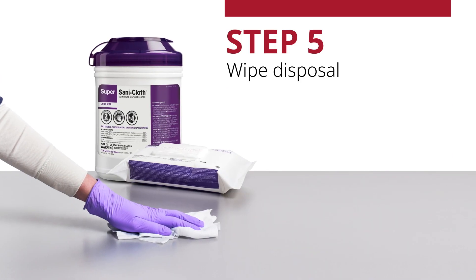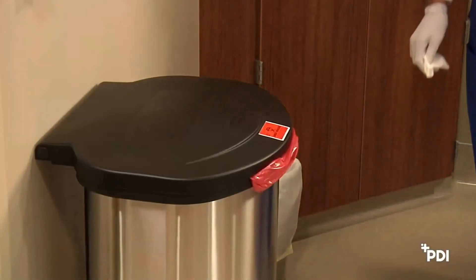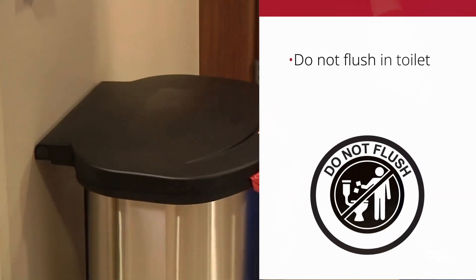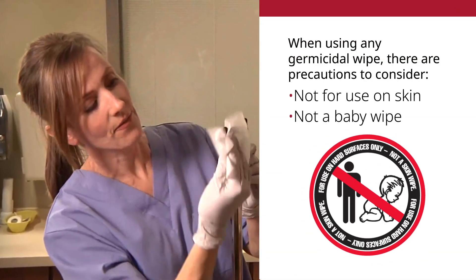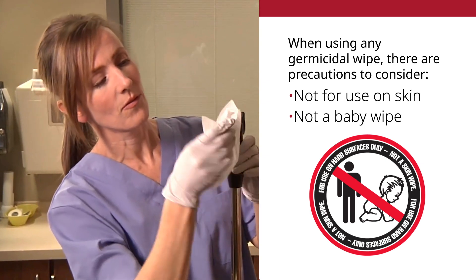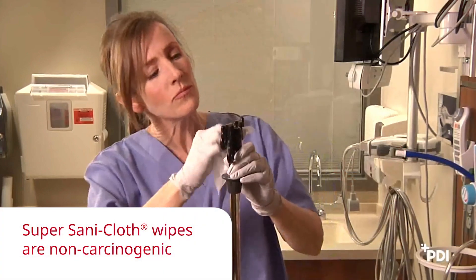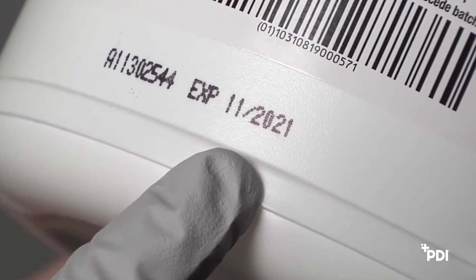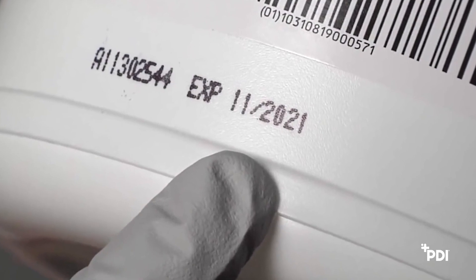Step 5: Wipe disposal. Dispose of used wipe in trash or in accordance with your facility's regulations for infectious waste disposal. Do not flush in toilet. Do not reuse the wipe. When using any germicidal wipe, there are precautions to consider: these wipes are not for use on skin — this is not a baby wipe. SuperSaniCloth wipes are non-carcinogenic. The product expiration date is stamped on the canister or on the soft-pack. This product has a shelf life of 24 months.